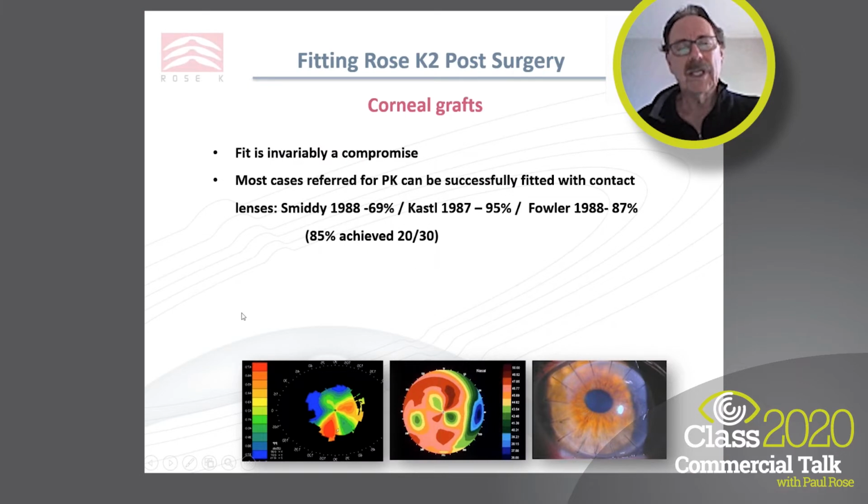So particularly with corneal lenses, a fit is often a compromise. It's very difficult to get a perfect fit, although I'll be showing you some pictures in a moment of some very good fits with a corneal lens on a graft.